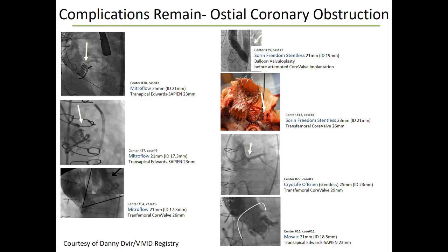One is gradients. The gradients, I think, are a problem due to constriction. And obviously, a superannular device, such as an Evolute R, offers some benefit in that the device is less constrained. The other thing that has helped is the interventionalists have gotten a lot better about higher deployment. Where we can play a role is using CT. And there's an important understanding around using CT around coronary occlusion.